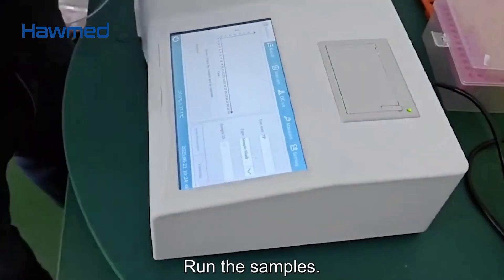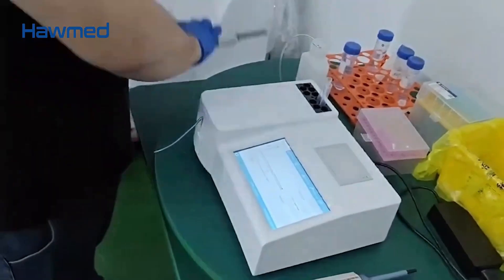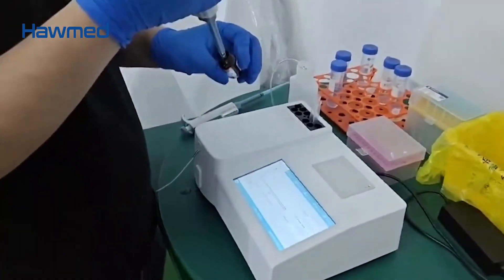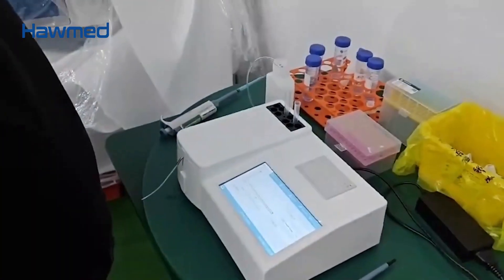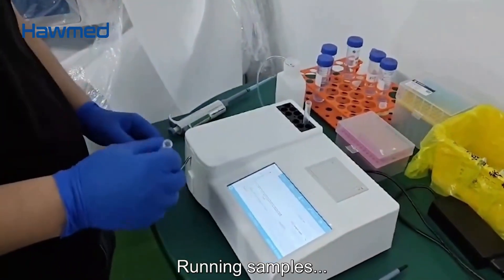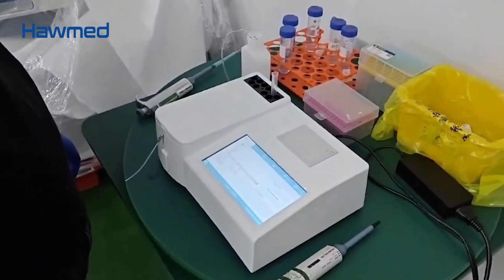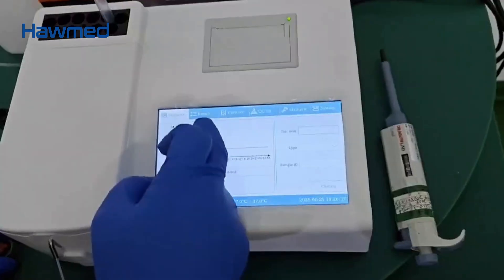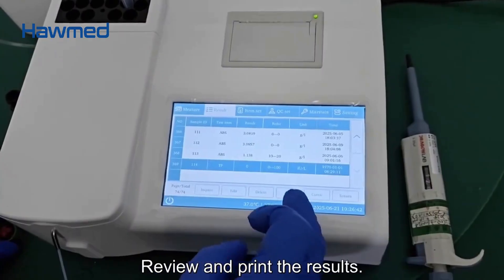Run the samples. Step 5: Review and print the results.